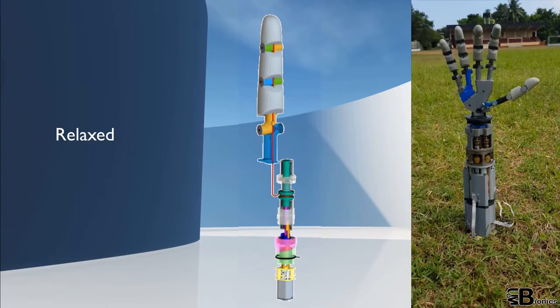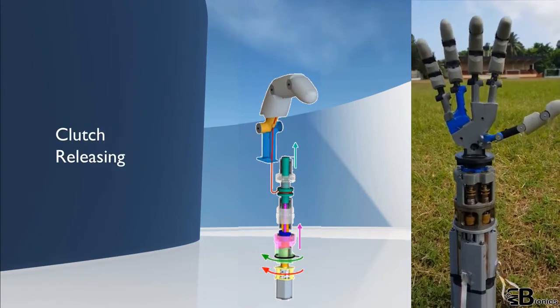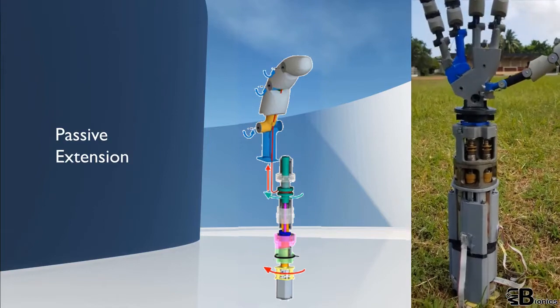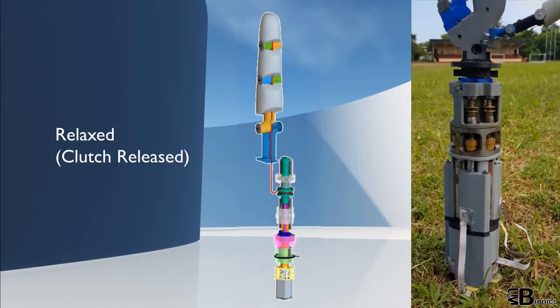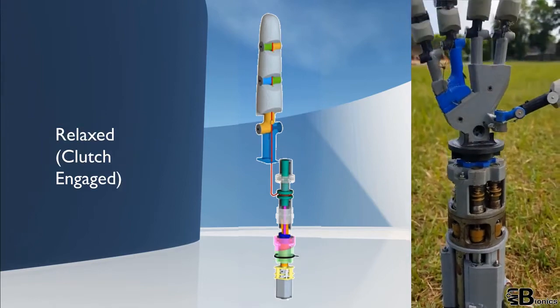The underactuated prosthetic fingers in Eyegrasp can achieve adaptive grasping through tendon mechanisms. The passive isometric hold is maintained using a clutch system with one-way bearings.